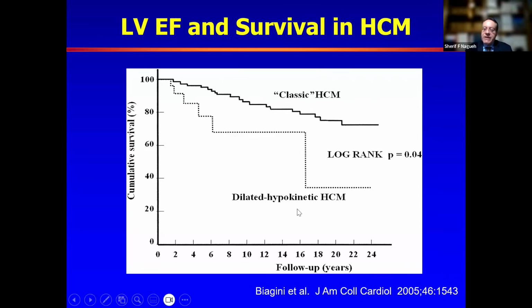In this phase of the disease, the ejection fraction will drop to the low 50s and lower, and here the outcome is much worse, more likely to progress to advanced heart failure treatments, and we do not use the usual drugs we use for the classic form of the disease, but the drugs you use for patients with heart failure reduced ejection fraction. So that's a key measurement by echocardiography to do ventricular systolic function by plain EF.